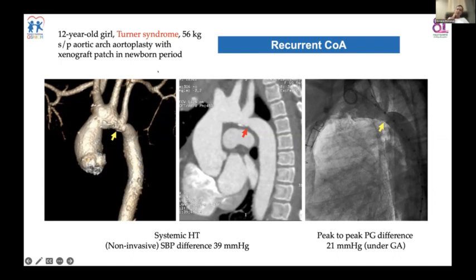So our worry at that time was the fragility of this vessel wall. As you can see here, and as Shaq mentioned, in this particular case the subclavian artery on the left side is somewhat smaller than the carotid artery, and we were quite concerned that if we put a stent here, it may cause an issue if it blocks the flow there. But we were not quite comfortable using the bare stent.